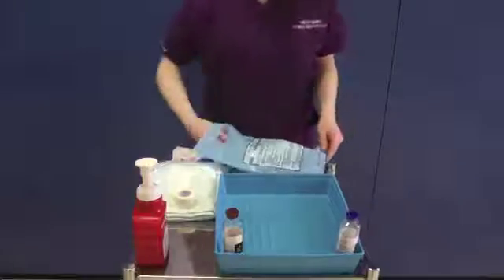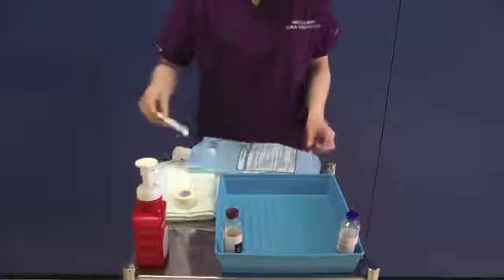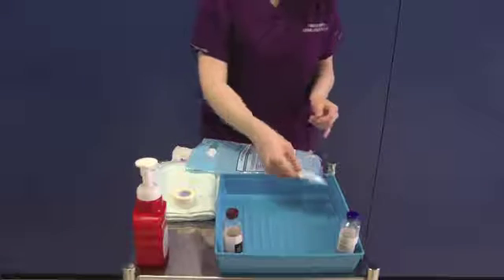Remove the rest of the contents of the blood culture collection bag, checking the expiry dates of the equipment when appropriate.